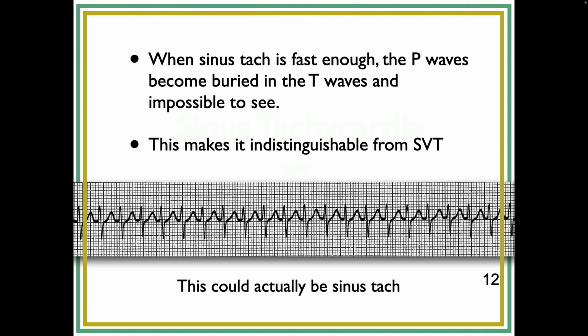When I say cardioversion, I'm distinguishing it from defibrillation. The difference is I'm using a little bit less joule energy, and I'm syncing it so you don't hit that vulnerable period, the relative refractory period in the heart. That's different than pacing, which is continuous shocking to speed up bradycardias, and it's much less energy.